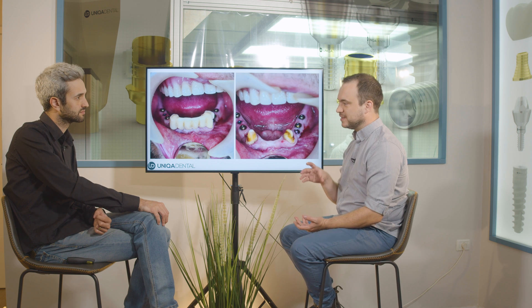Are any final bridges also made for resting on teeth? What are the benefits of making a bridge rest on teeth and not implants? When the implant is not osteointegrated, the problem is that the implant is in the bone only because of the mechanical holding — because of the pressure and the torque with which you inserted the implant into the bone.